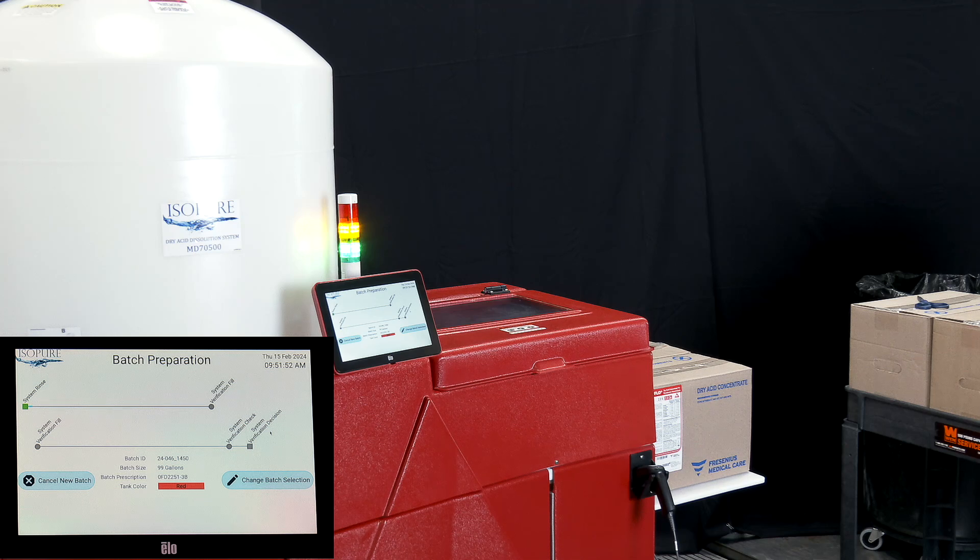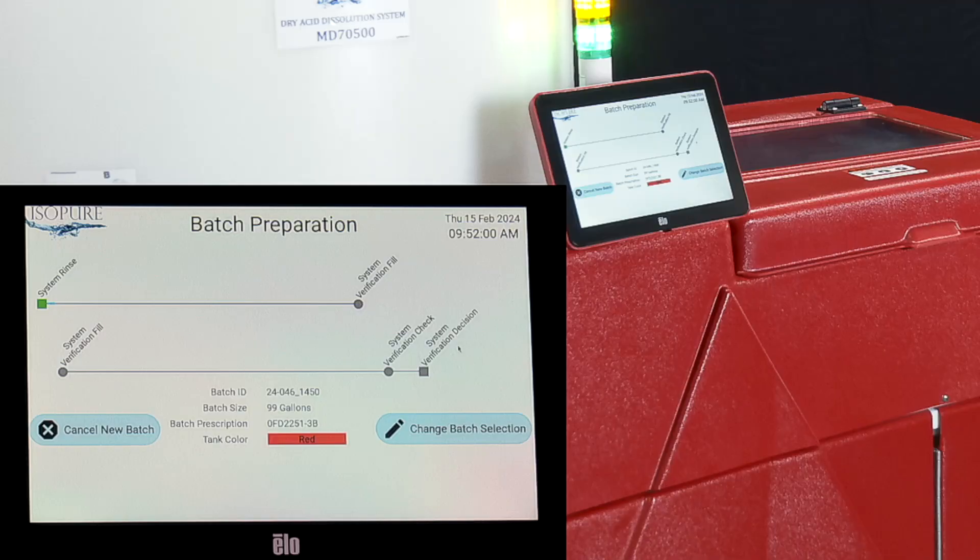Acumix will now perform the batch preparation process. During this step, the tank performs a rinse and self-verification. At a maximum flow rate of 3 gallons per minute at PSI 60, a 99-gallon batch should take about an hour to complete this step.